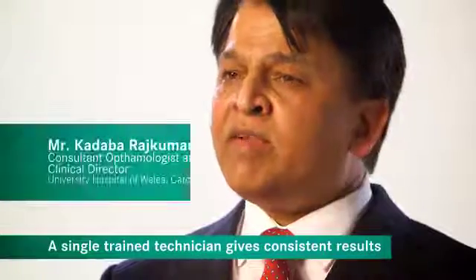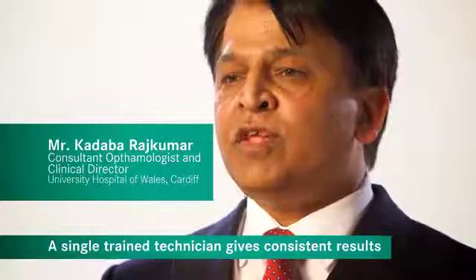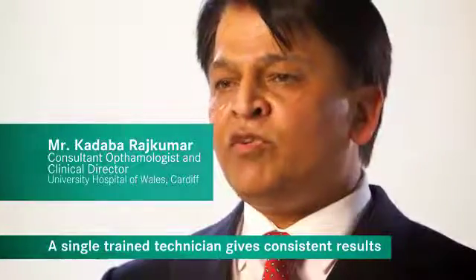The analysis tool of the KOWA camera is actually a very excellent tool that you should definitely use, because it gives you a more accurate impression of how the optic nerve head is developing, even more accurate than you can see it with your eye. And a good tip that I have there is really using the stereoscopic view and using the stereoscopic point of view to mark the outline or the contour of the optic nerve head. That helps a lot. I would certainly recommend development of a team where a single person is using the camera constantly so that you get consistently reproducible results.